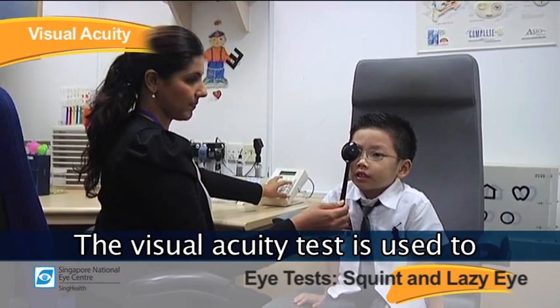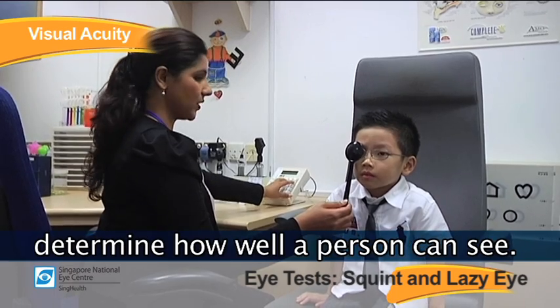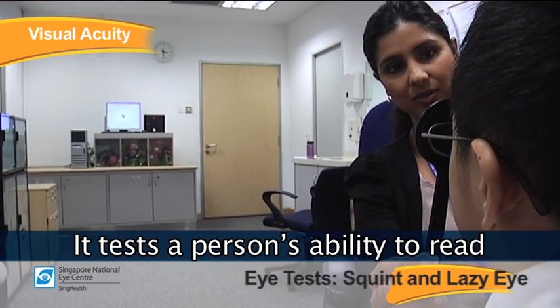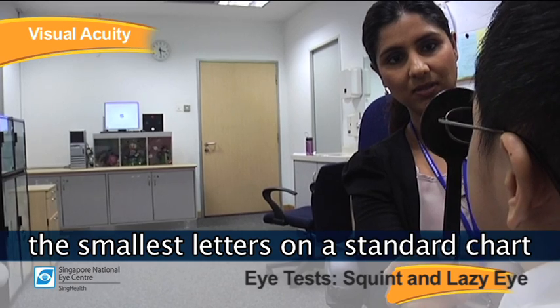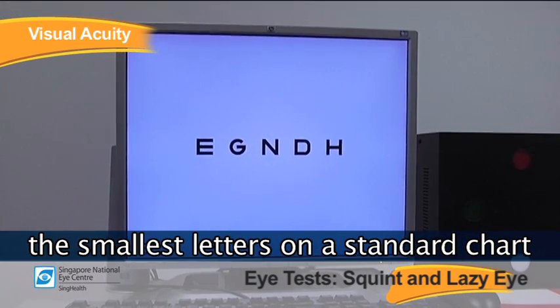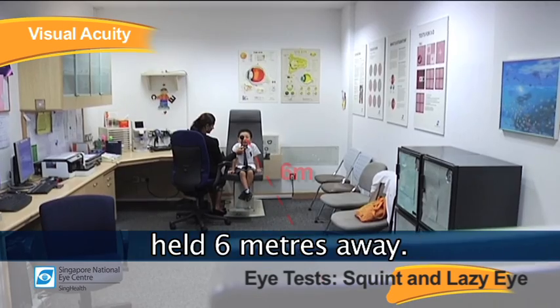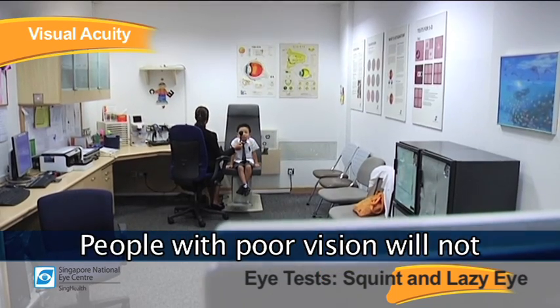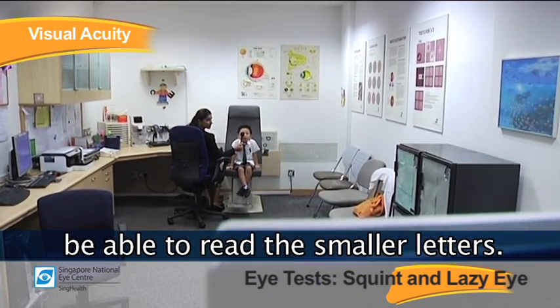The visual acuity test is used to determine how well a person can see. It assesses a person's ability to read the smallest letters on a standard chart called the Snellen chart, held 6 metres away. People with poor vision will not be able to read the smaller letters.